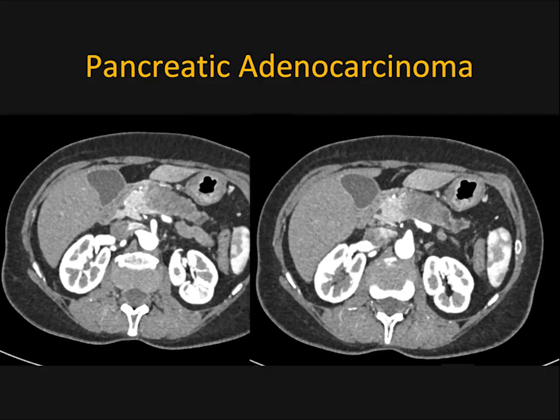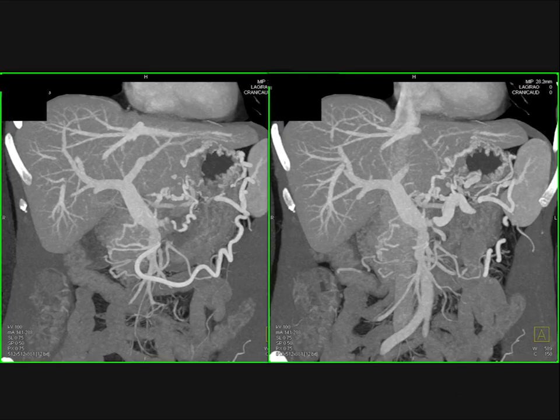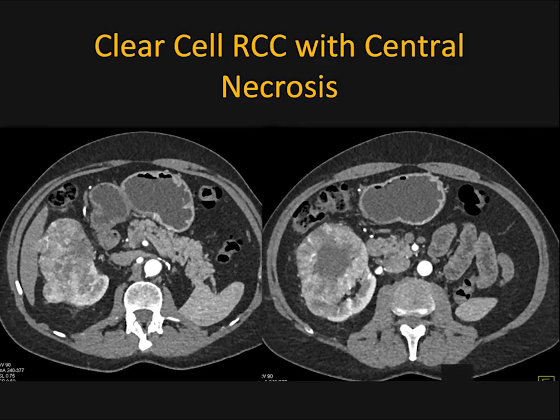We know the same thing is true in pancreatic cancer. Adenocarcinomas are typically hypodense. We'll use CT to define vascular involvement, whether it's on the arterial or venous side. We'll look at SMA and celiac and hepatic artery and portal vein and SMV. We'll look at the liver, in this case an accessory right hepatic artery. And then, of course, in that same patient, the occlusion of the splenic vein with multiple collaterals. Now, splenic vein occlusion alone does not make you unresectable. Portal vein involvement with the SMV for a distance will make you unresectable.